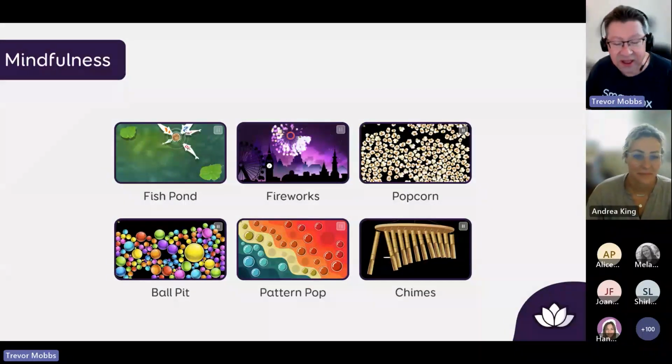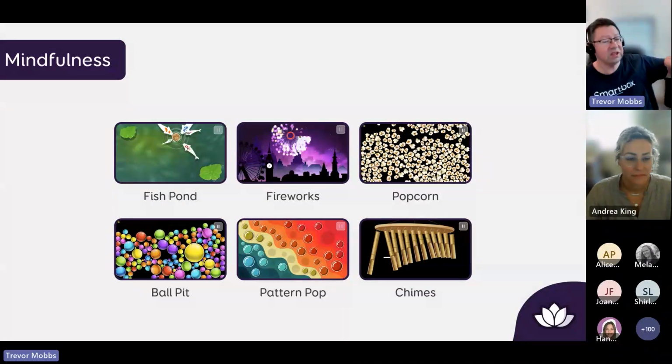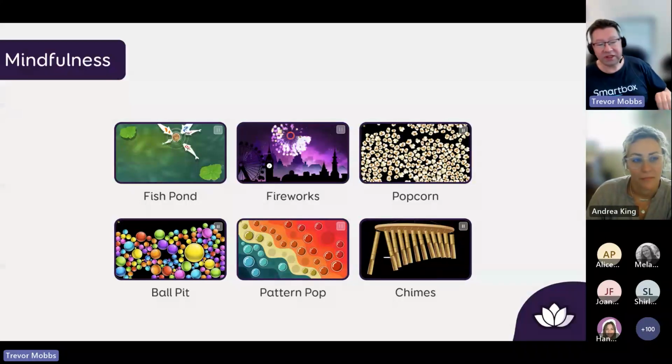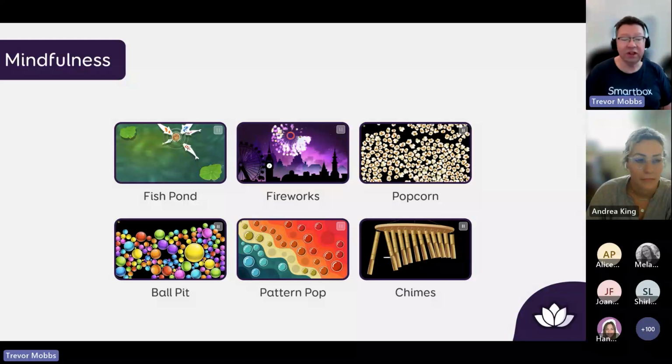You can spend hours doing that, and that's essentially what this activity is about. But to complete one level of pattern pop, you need to pop all the bubbles on the screen. So that's a really good one for practicing moving your eye around every area of the screen, but also as an assessment tool. It quickly becomes evident if some areas of the screen are more difficult than others. So you can use some of these activities in lots of different ways, really.